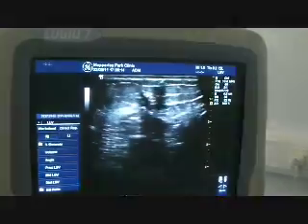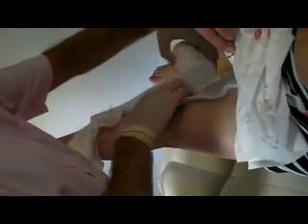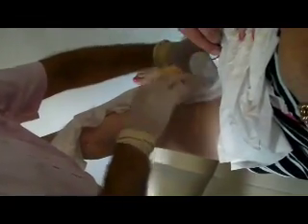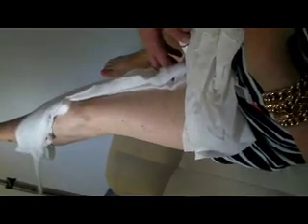Once the treatment has been completed and the doctor is happy, it's then a matter of compressing the vein, as that's how the foam sclerotherapy works. First a roll of cotton wool-like material called velband is placed over where the vein is and the needles are all removed. The compression is the most important part of the procedure, as the chemical that's been injected causes the vein walls to become sticky, and it's the compression that sticks the walls of the veins together. This is why patients treated by vein care doctors need to have compression for up to five or six days after their treatment.